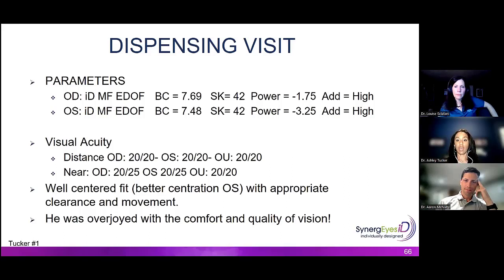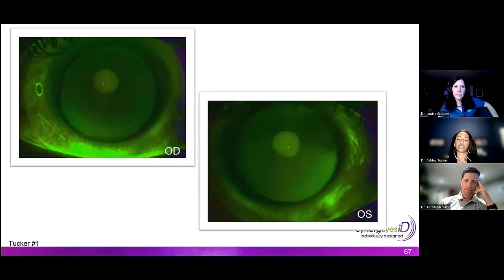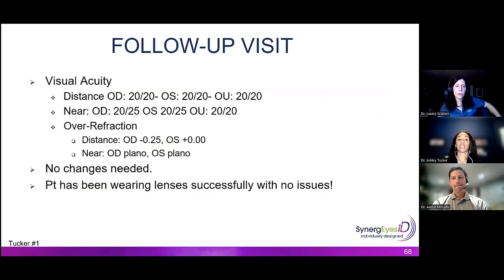This is a picture of the lenses at dispense. There's a little bubble underneath the skirt, but that is totally okay. The lens was a little off-centered in the right eye, better centered in the left, but the patient was comfortable. The optics were great, so I did not press the issue there. And this goes to show with the EDOF, it does not have to have perfect centration, unlike center distance or center near. Exactly.